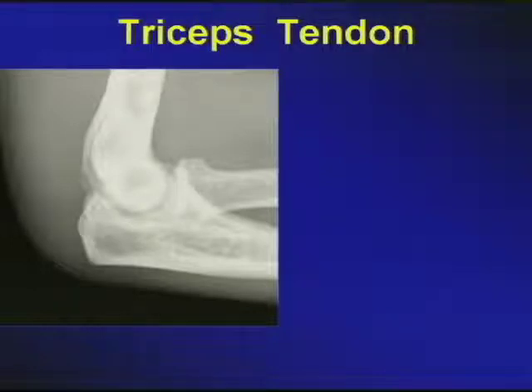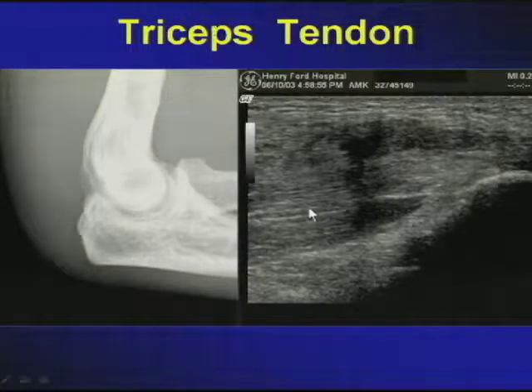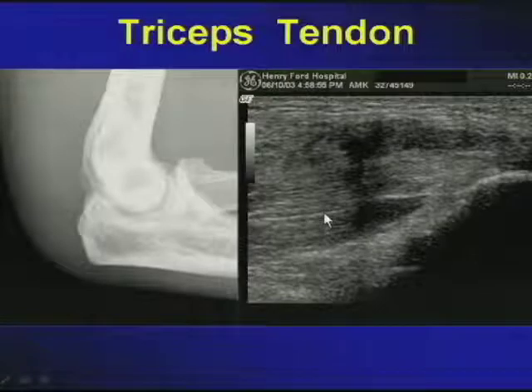You'll note that not only is there soft tissue swelling around the olecranon fossa, but also that the soft tissue swelling goes entirely around the ulna. And if you look immediately around the cortex, you may appreciate a small and minor cortical irregularity. Well, it's very easy to bring him over to the ultrasound, which is also equally accessible as the musculoskeletal radiologist.